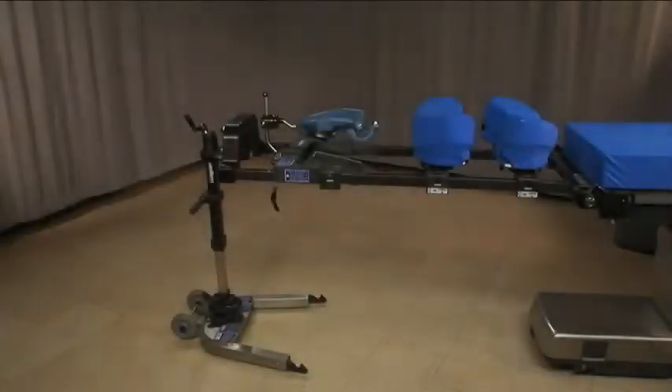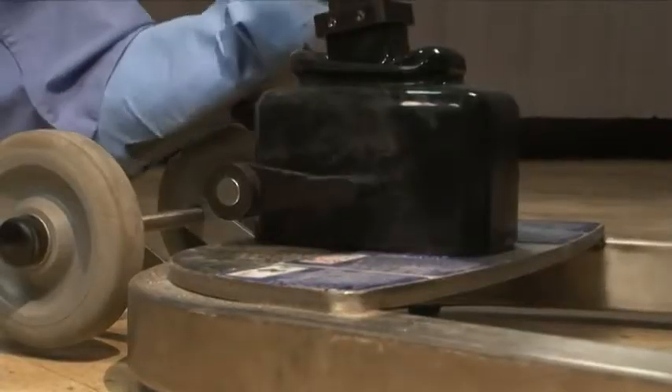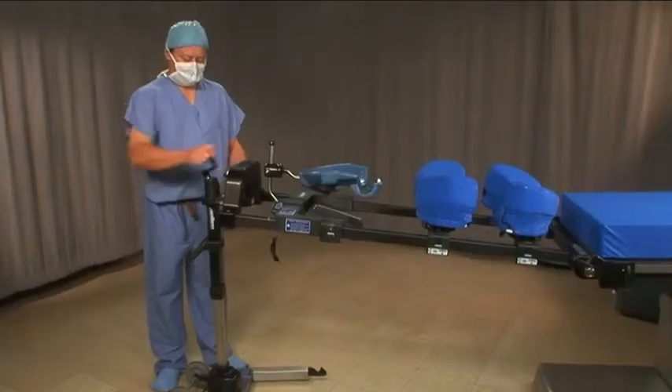When removing the FlexFrame from the OR table, make sure that the base is unlocked. Bring the frame to its maximum height.